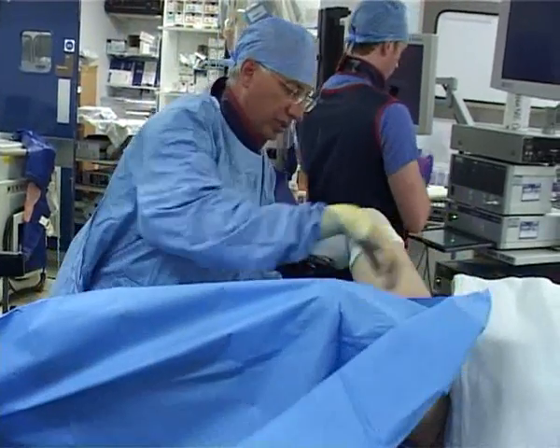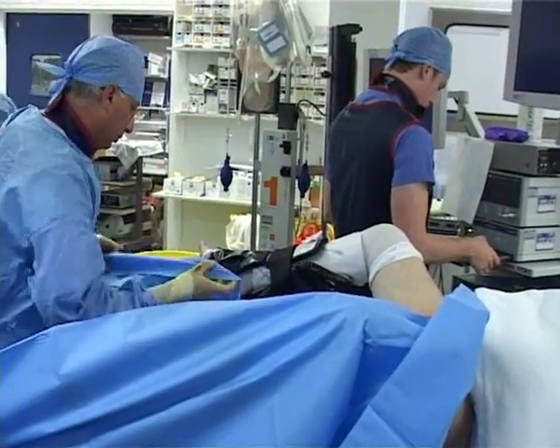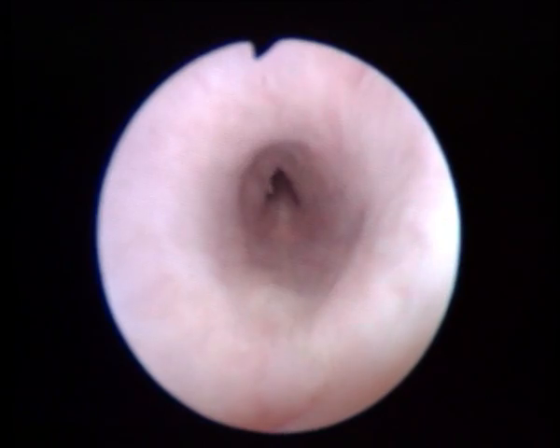The procedure is performed under spinal anesthesia with the patient in the lithotomy position. Flexible cystoscopy demonstrates the lack of uroepithelial ingrowth and the urethral patency. It is visible that the proximal end of the 2 stents is at the bulbourethra. As the flexible cystoscope is removed, the junction between the 2 Memocath stents is visible.